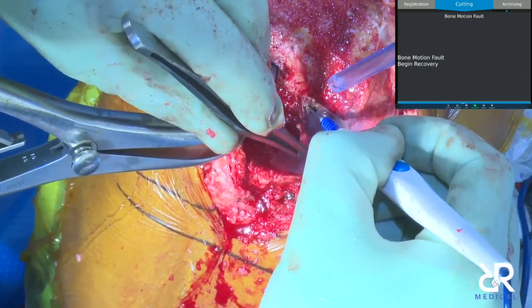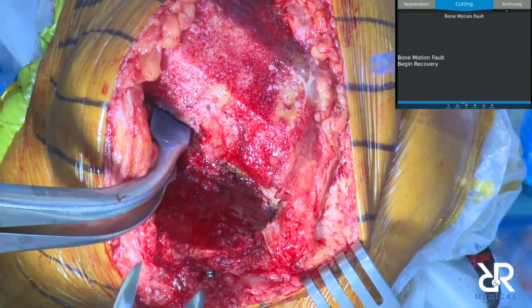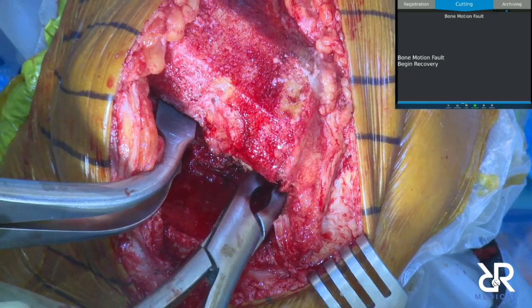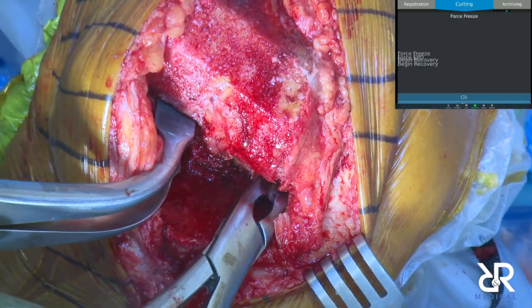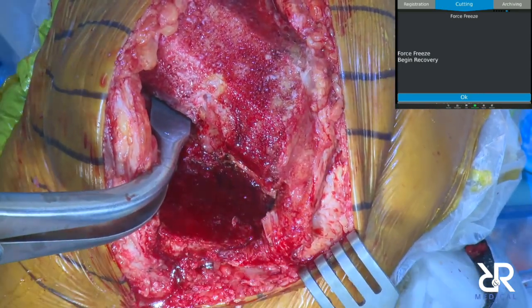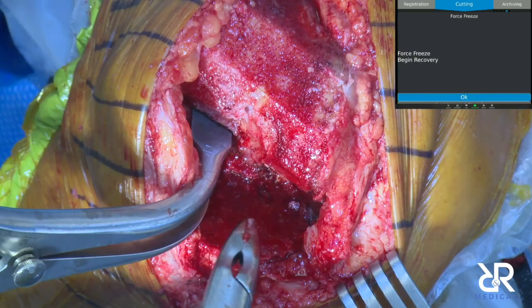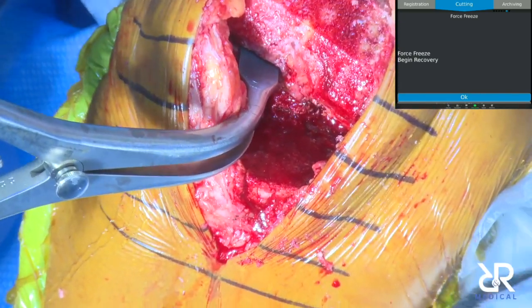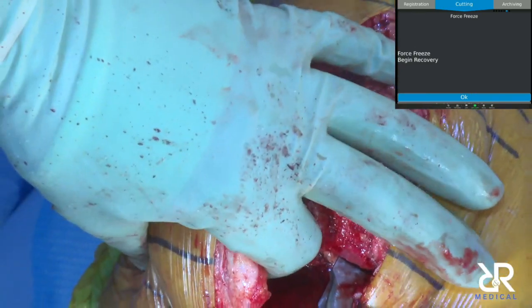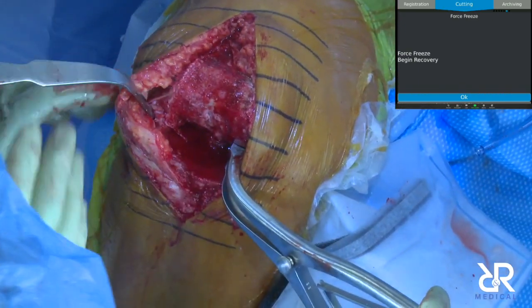What were the cuts on the tibia, Brian? 7.5, 5, yeah. So one time we had to do a recut on the tibia because I didn't put enough slope in it. You still have to have your regular instruments available, of course. So we recut the tibia with a little bit more slope. But I think that's the only case, Brian, right, where we had to recut? So generally, if you plan it right, you should not have an issue.